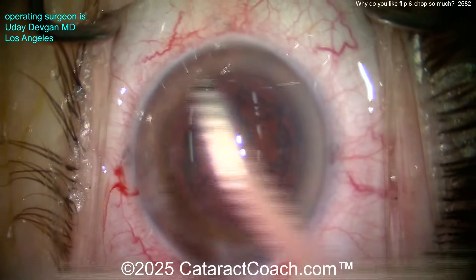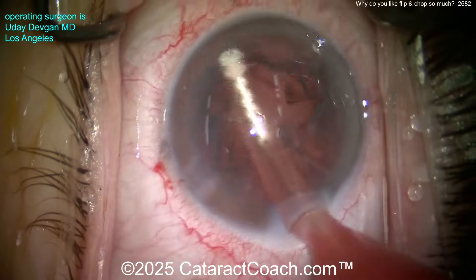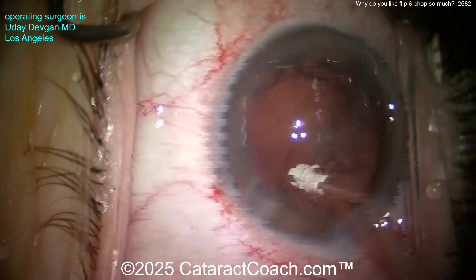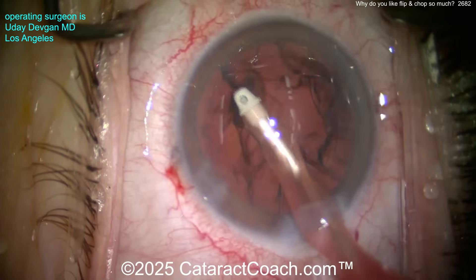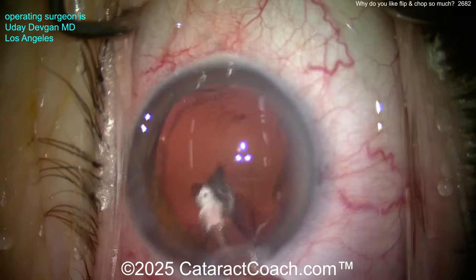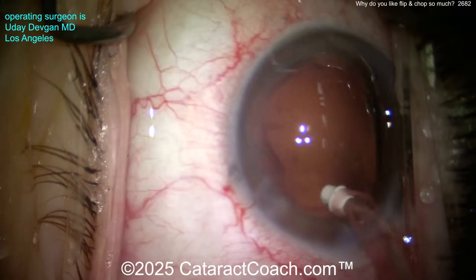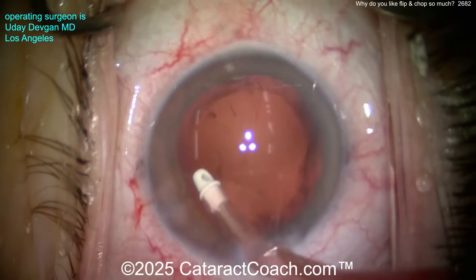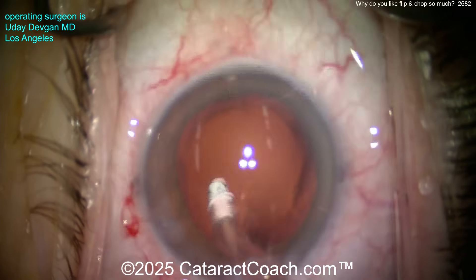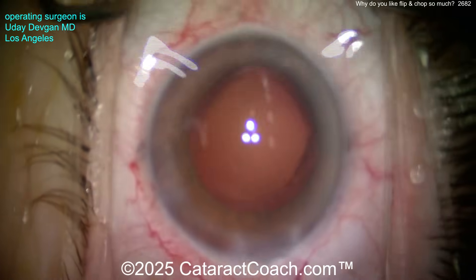Going back here — here comes the I/A probe, and we'll take out the lens cortex and clean this capsular bag nicely. I can't have the risk that the capsule is going to break from too much manipulation, or cause zonulopathy from too much stress in the capsular bag. You've seen patients where you do a divide and conquer, stop and chop, or even a regular chop in the bag, separating two halves, and you ask yourself: how much stress are we putting on the capsular bag and zonular support?